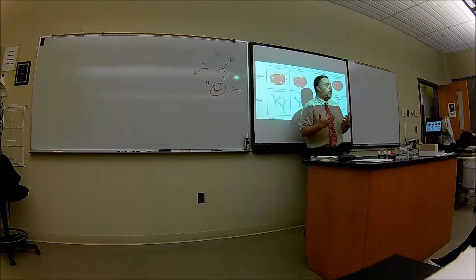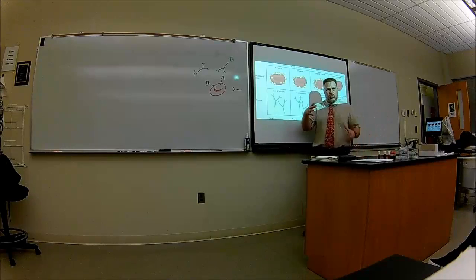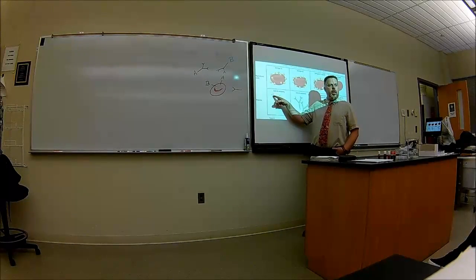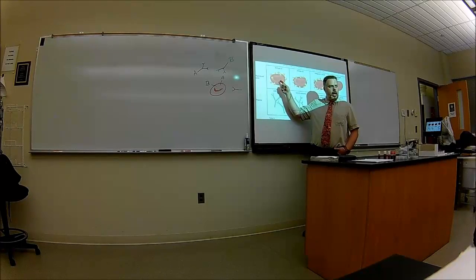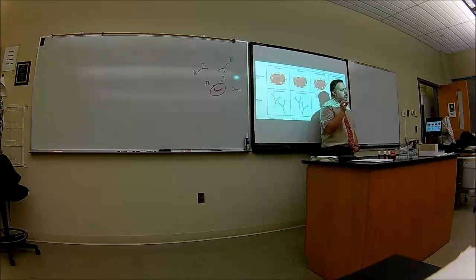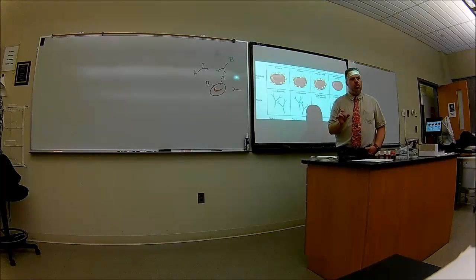Again, it's just showing schematically. It's not real life, but it's so you can visualize what's going on here. These triangle-shaped patterns don't fit onto the balls there. So these can live in harmony. Antigens to A, antibodies to B. That's what happens in a person who has A blood. Okay? Questions on that? Okay.